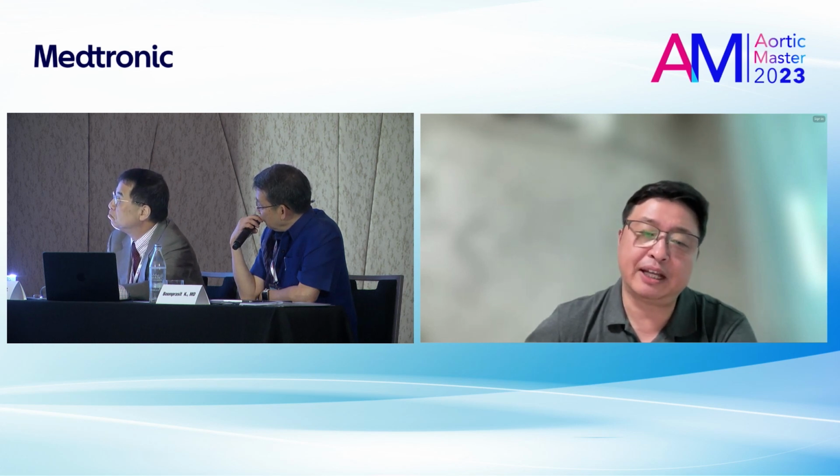I see. And what about the transarterial approach? Do you use it, or do you recommend direct puncture as better? If the IMA is patent, these days I try to use the SMA-IMA approach. But if the IMA is blocked, I first try the transarterial approach from the internal iliac artery.